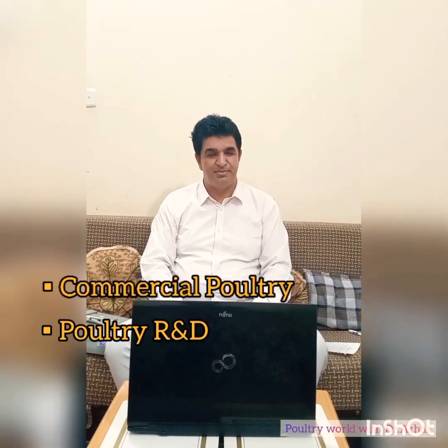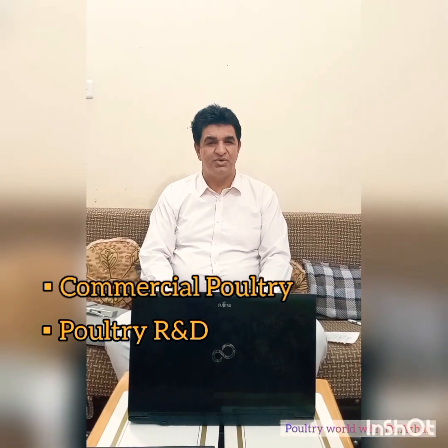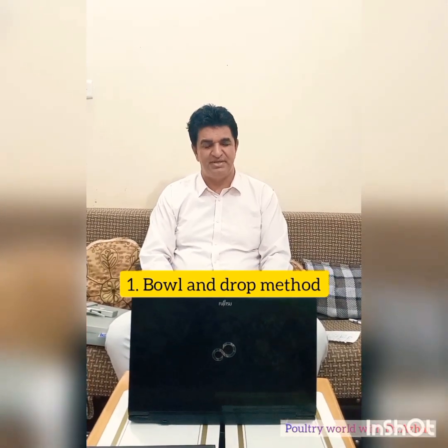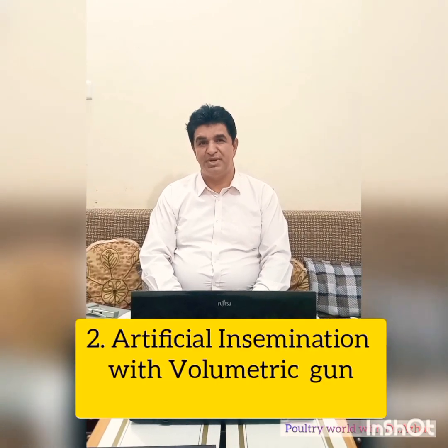It is a very useful tool for commercial poultry and poultry R&D. There are two ways by which poultry insemination is done. One is the bowl and drop method — a very old method, not much popular because of contamination issues and being very slow. The second one is artificial insemination with a volumetric gun.